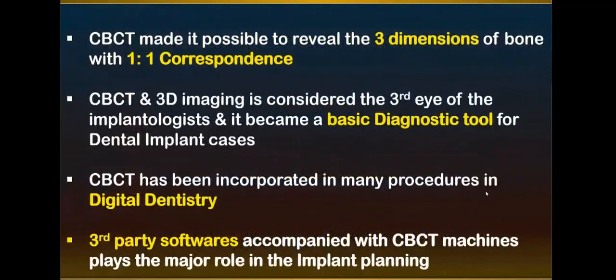First, the CBCT is the pioneer modality for implant cases because it gives the 3 dimensions in one-to-one correspondence. The CBCT is considered like the third eye of the implantologist. For this reason, it became a basic diagnostic tool for implant cases.